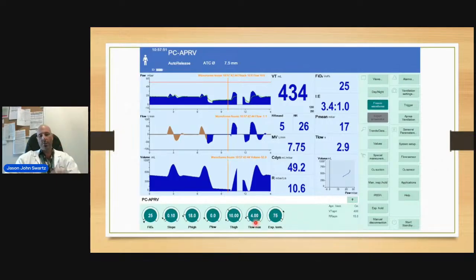But for some reason, your T low max, which is a limit, you set it to 0.4. It means that it'll try and do the calculation of 75. The actual correct T low would be, let's say, 0.7, but you went and set a T low max at 0.4. It means like I will allow you to do the calculation, but I won't allow the T low max to go more than X, whatever number. So you don't want to interfere with the auto release. So just keep the T low max well out of the way at 3-4 seconds.